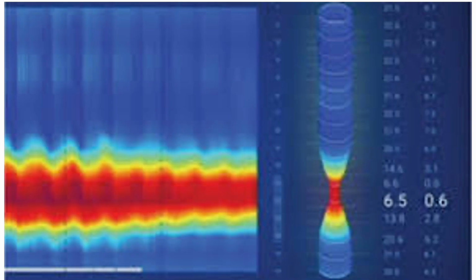So the EGJ is less distensible, or it's tighter than normal in the waist. And we read it as 6.5 millimeters is the D-min, or the minimum diameter at the narrowest point. And the one on the right, that's 0.6, is mm square per mm mercury, which is the distensibility index.